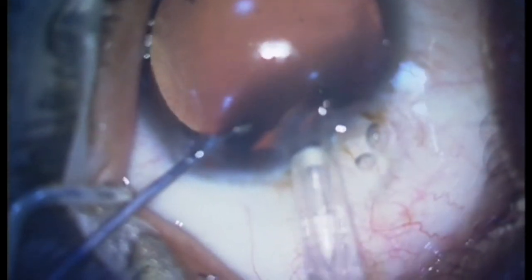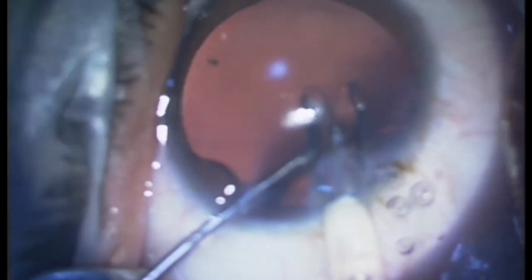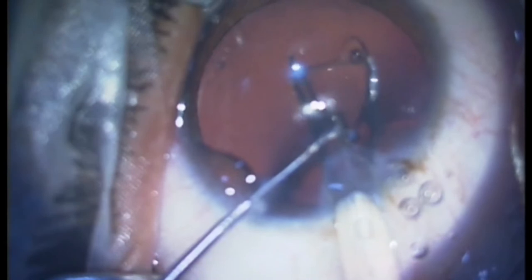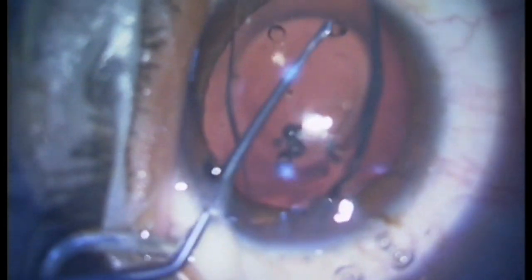Next, RIOL is injected into the anterior chamber with a slow controlled push technique, with vault facing up and the peripheral hole of the leading haptic visible along the right-hand side.